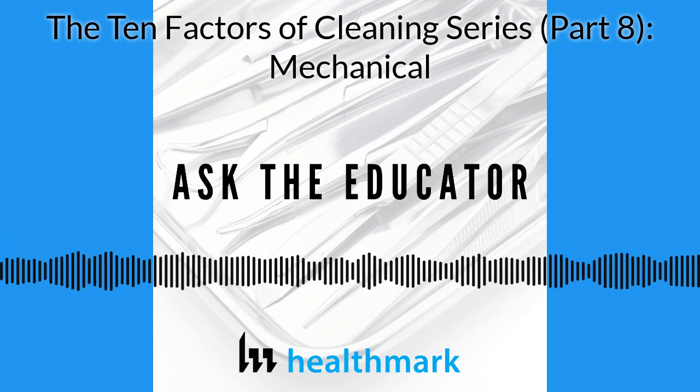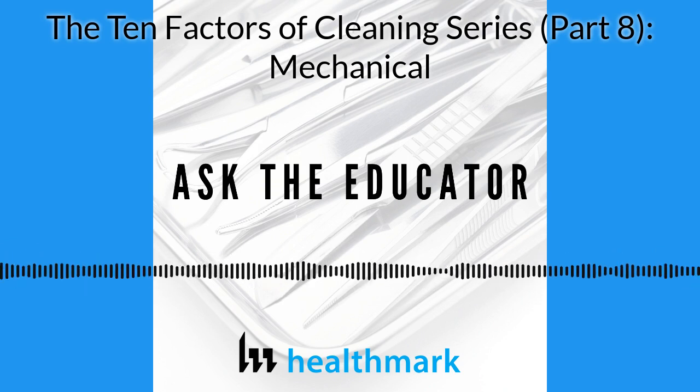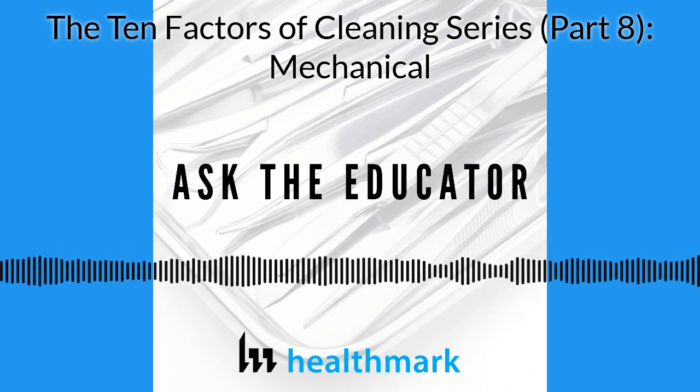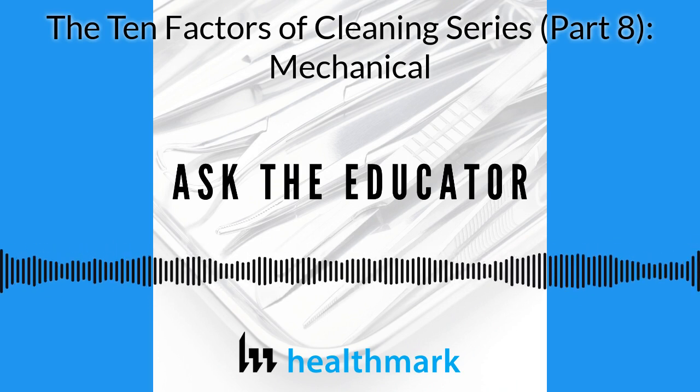We were talking about this on another webinar I was just doing, but absolutely, you run these tests and make sure that all the facets of whatever your ultrasonic can do are working properly, because each one could be affected in an isolated manner. Your lumen flushing capability could go down, but the rest, like the cavitation, could be functioning just fine. So it helps you to understand why you're running the various tests, but also how you can use that equipment should something go wrong.